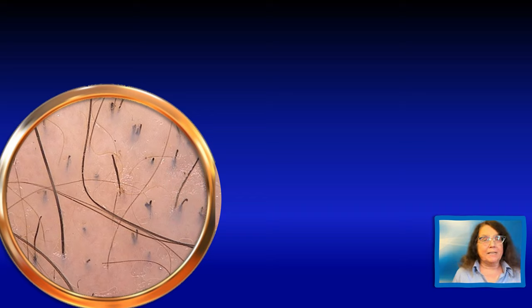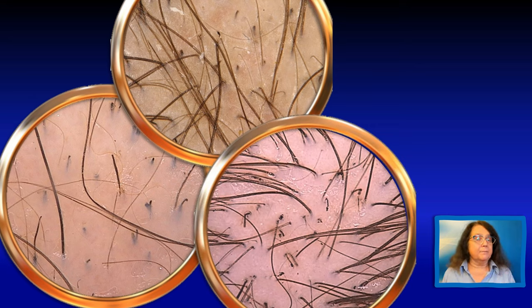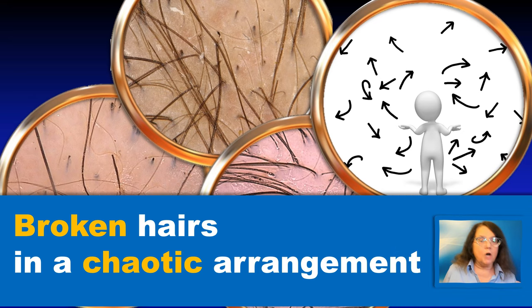Yes, we expect to see multiple broken hairs, and usually they are in a chaotic arrangement, just as you see in this image. And also in this patient, you will see many broken hairs, and they are arranged quite chaotically. And also here, many broken hairs and no real order. There is a chaotic arrangement of these hairs which are left. So the most common feature of trichotillomania in trichoscopy is the presence of multiple broken hairs in a chaotic arrangement.